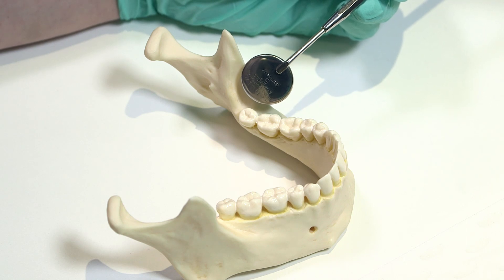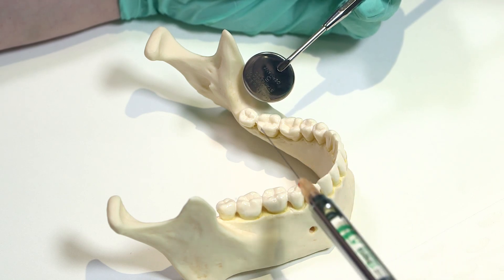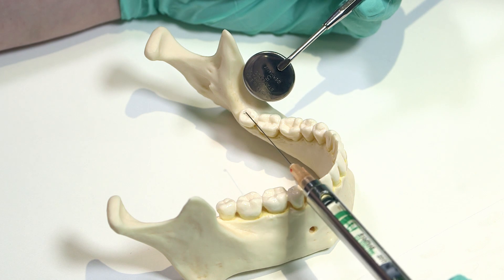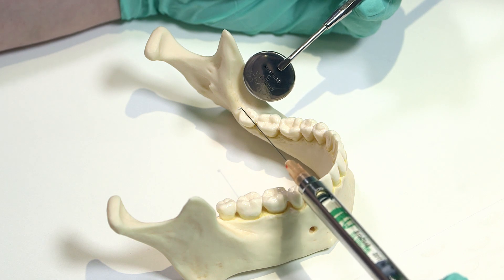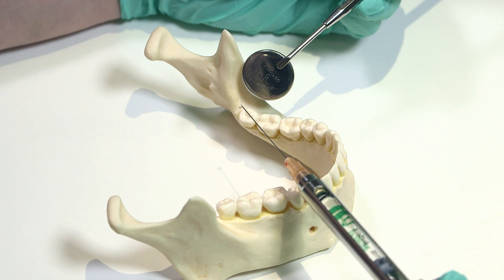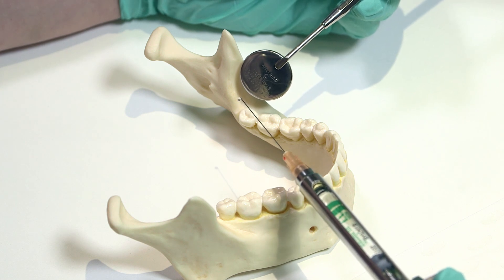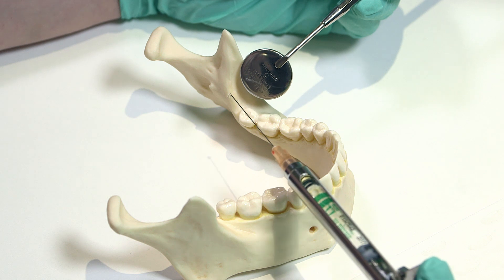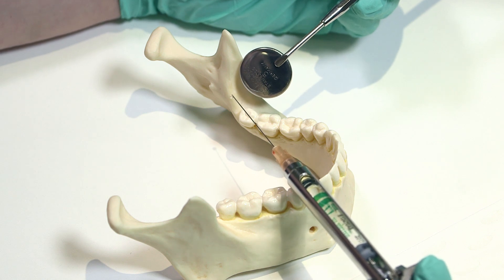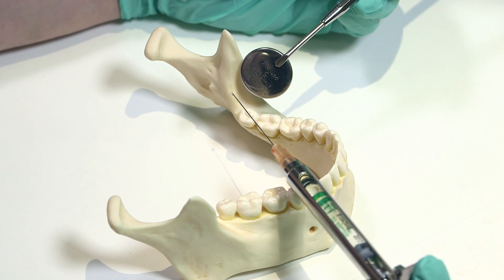We're going to place the syringe barrel over the contralateral premolars and prepare to insert the needle. The height of insertion is determined by a number of factors including the coronoid notch and the deepest point of the depression.